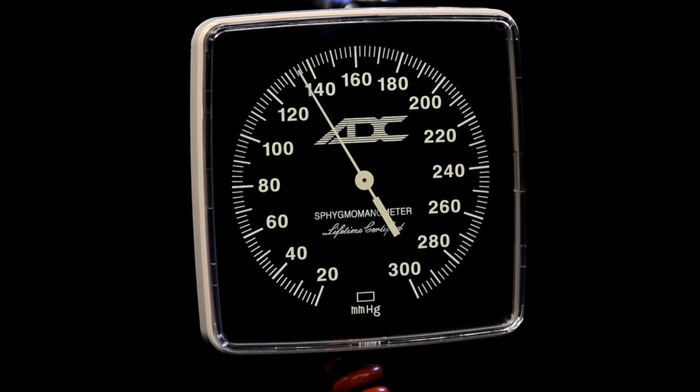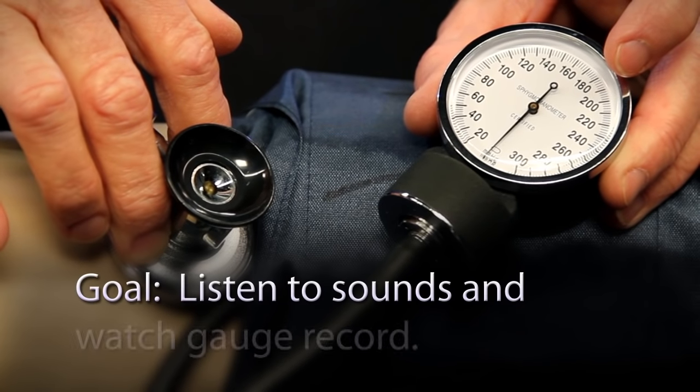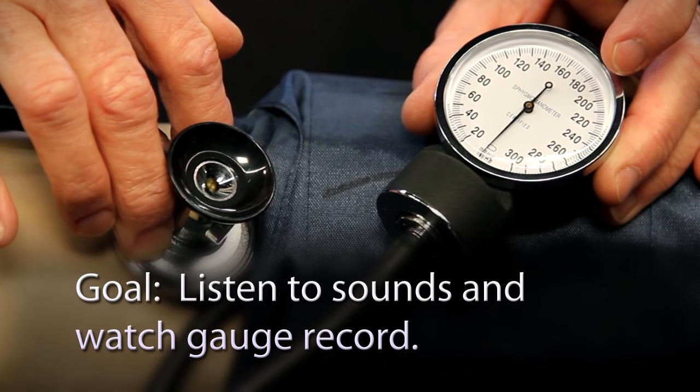The instrument used is called a sphygmomanometer. You will be able to say this word. It takes a bit of practice. A manometer is a device that measures pressure. Sphyg, which rhymes with fig, relates to blood. Broken into its parts, it is sphygmomanometer.